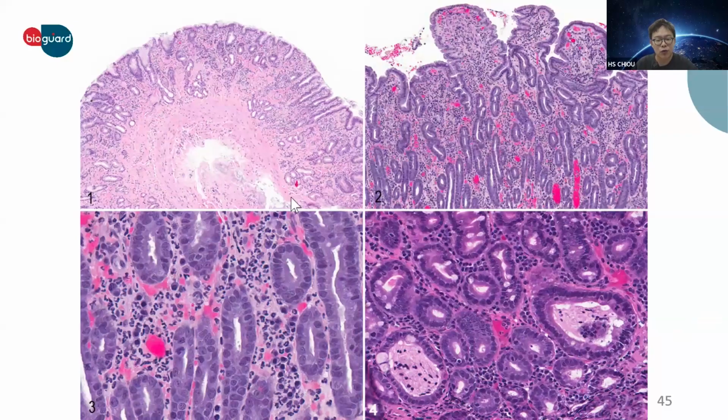So when you look at these 4 images together, you can see both domains we've been discussing before. Inflammation, such as increased neutrophils, lymphocytes, and plasma cells, and structural remodeling, such as villous atrophy, fibrosis, and crypt dilation. And remember, structural parameters often correlate more consistently with clinical disease activity than mild inflammatory infiltrates alone. When you review biopsy images like these, don't just count inflammatory cells.